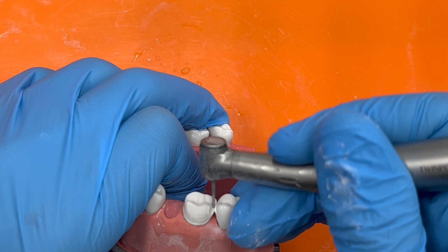Once that is done, I switch to a 014 red chamfer and start rounding line angles, smoothing the preparation and lowering the margin. My aim is to keep the margin at a height between 0.5 and 1 mm.